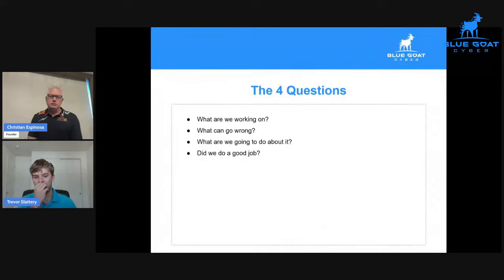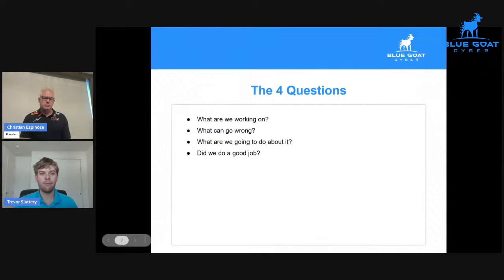All right. So as per the MITRE playbook for threat modeling medical devices, there are 4 big questions that we have to ask. And a lot of this is already covered by some of the things that we've looked at. So the first being, what are we working on? That's usually going to be the threat diagramming process. We're trying to understand the device. We're trying to understand what it is, what it's doing, how can we best represent the product.